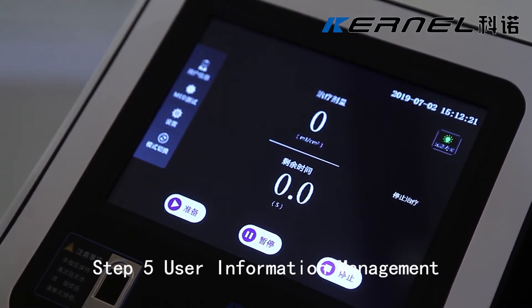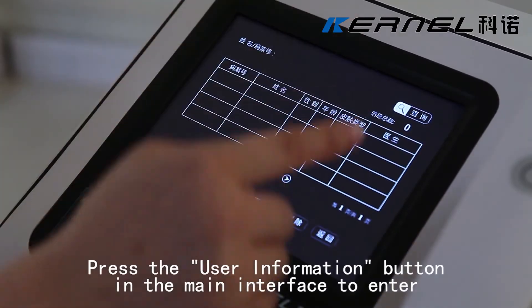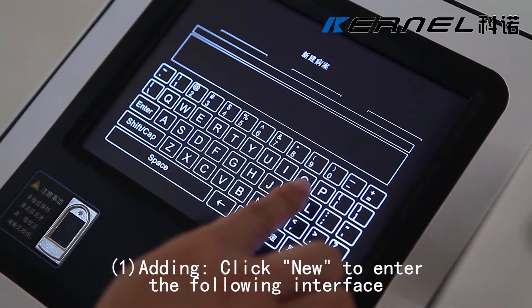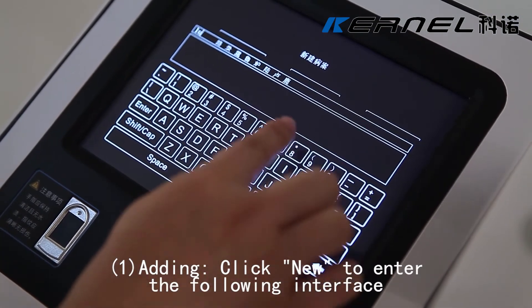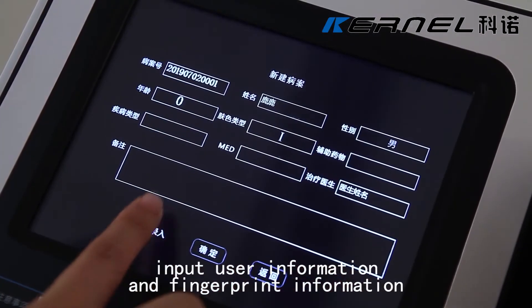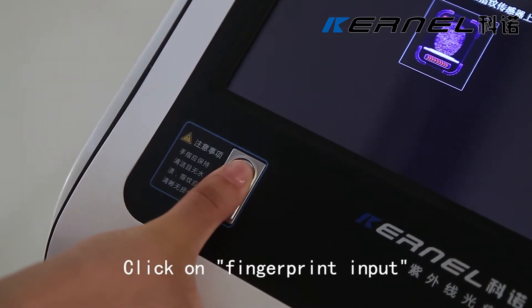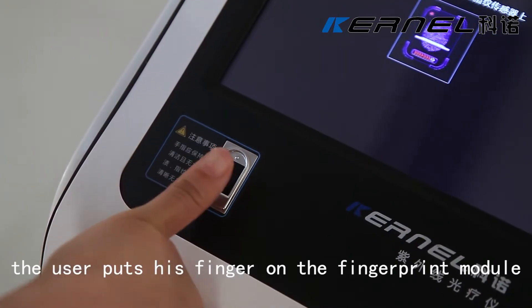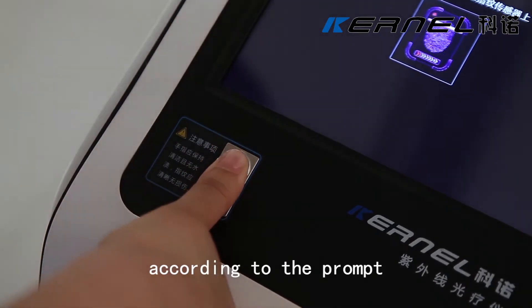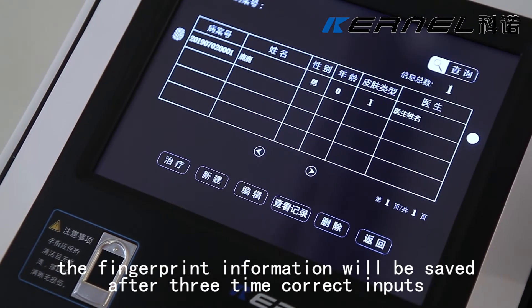Step 5: User Information Management. Press the user information button in the main interface to enter. To add a user, click New to enter the following interface. Input user information and fingerprint information and click OK to save. Click on fingerprint input — the user puts his finger on the fingerprint module according to the prompt. The fingerprint information will be saved after three correct inputs.